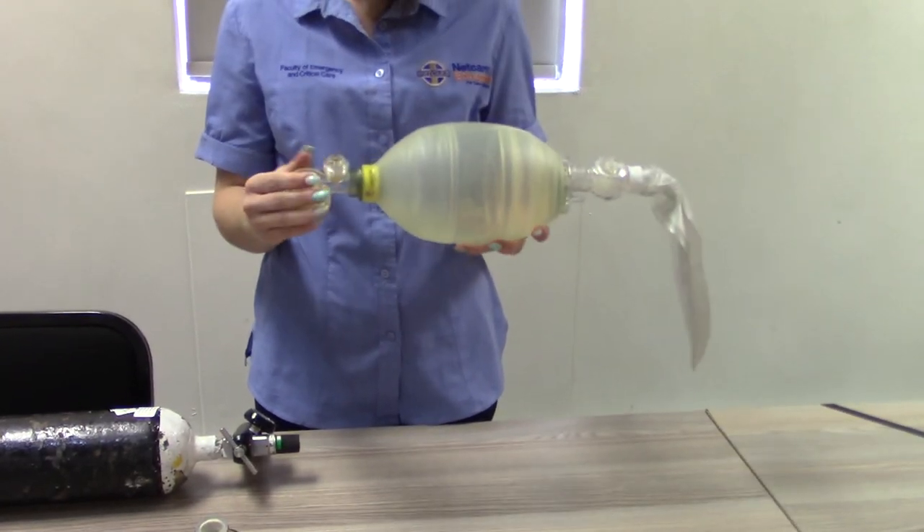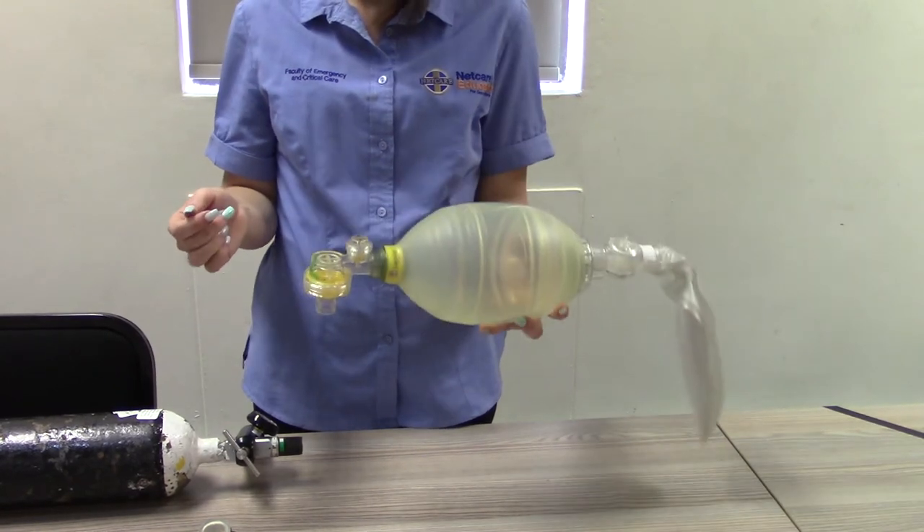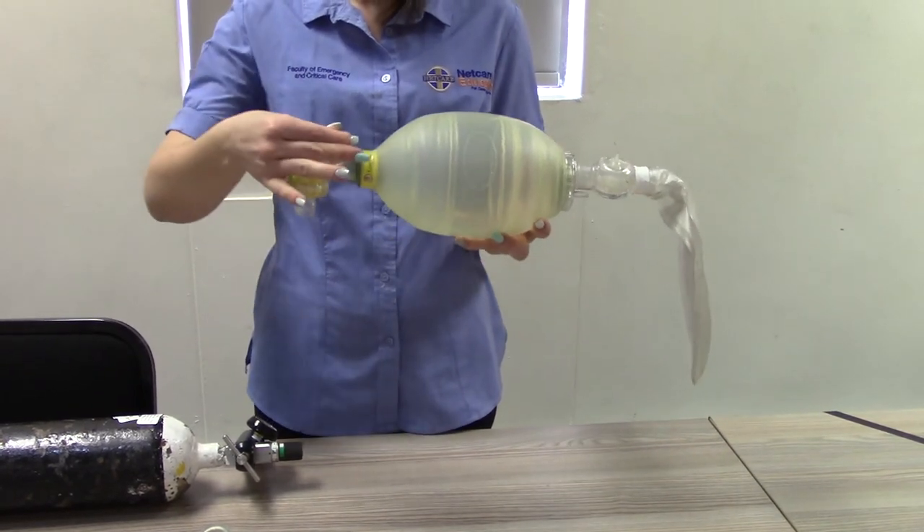Occlude the patient connection port with your hand and compress the ventilation bag to generate pressure, with the pop-off valve unlocked, to ensure the pop-off valve is functioning correctly.